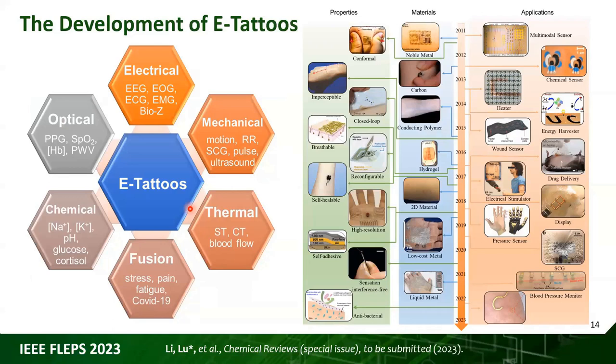What's the endurance of the nanometer thickness film? The skin will go multiple cycles of endurance when mechanical. So it shouldn't really break. Have the cycle tested? Yes, that's a great question.